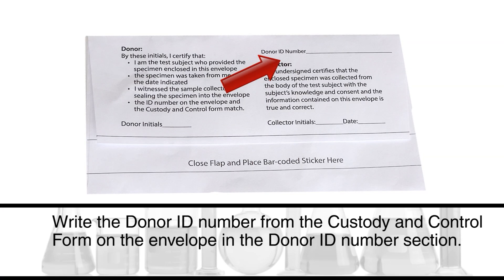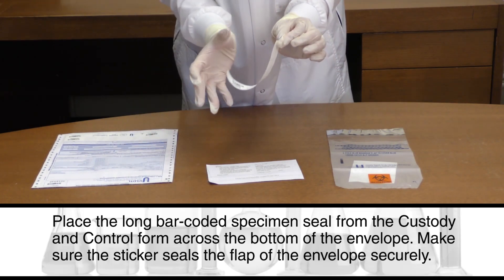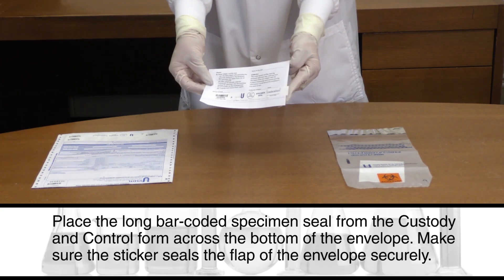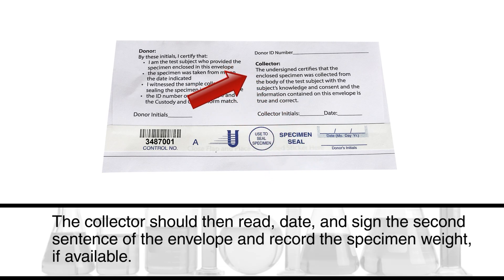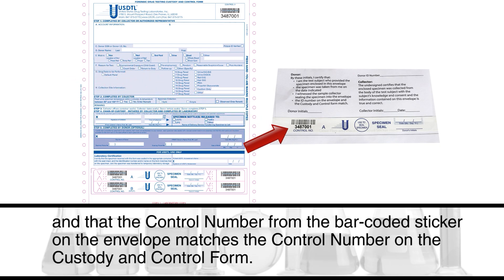Write the donor ID number from the custody and control form on the envelope in the donor ID number section. Place the long bar-coded specimen seal from the custody and control form across the bottom of the envelope, making sure the sticker seals the flap securely. Have the donor read and initial the first sentence on the envelope, and date and initial the bar-coded specimen seal where donor initials is indicated. The collector should then read, date, and sign the second sentence of the envelope and record the specimen weight if available. The donor and collector should both confirm that the donor ID number on the envelope matches the donor ID number on the custody and control form, and that the control number from the bar-coded sticker on the envelope matches the control number on the custody and control form.